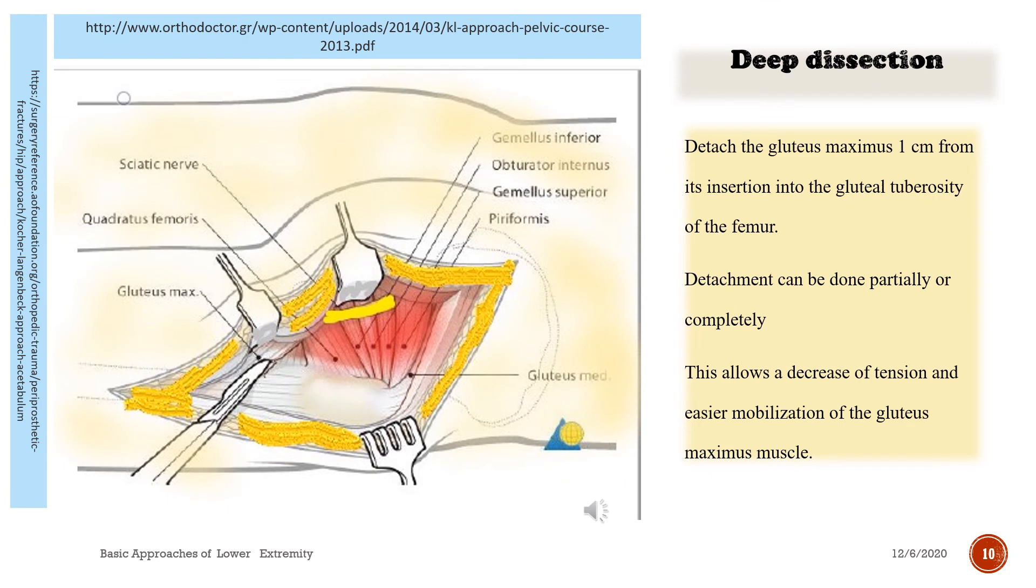Detach the gluteus maximus one centimeter from its insertion into the gluteal tuberosity of the femur. Detachment can be done partially or completely. This allows a decrease of tension and easier mobilization of the gluteus maximus muscle.